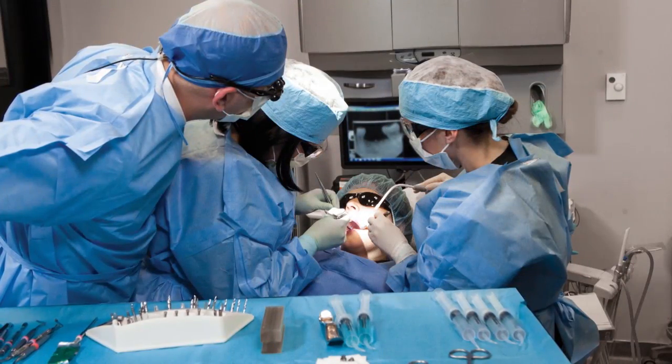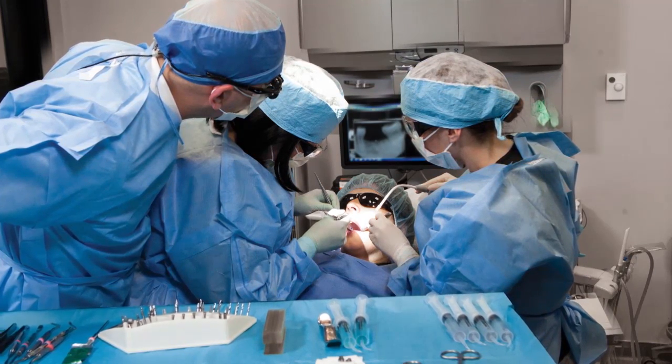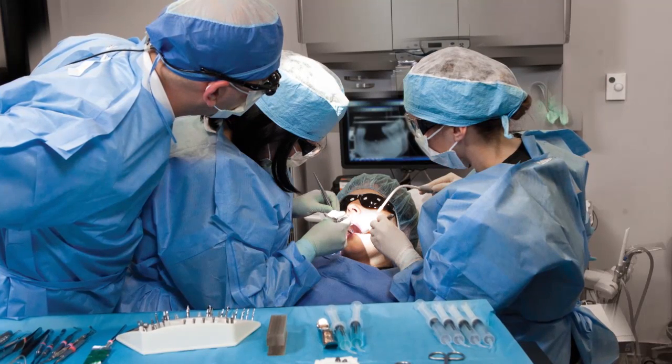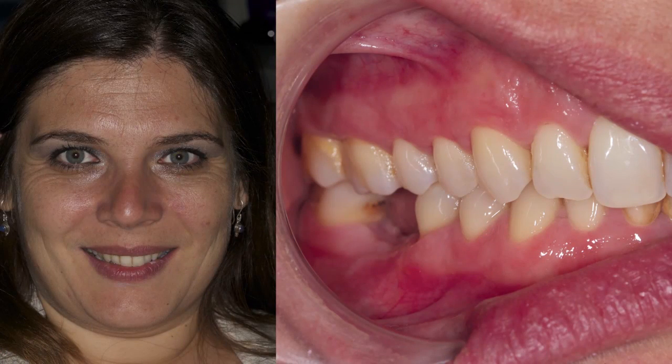For this implant case, I would like to start by saying that it was an implant I placed soon after I graduated dental school. Because of that, I had to rely on a relative or my best friend for that kind of trust from my patient. I was very lucky to have Dr. Abai as an innocent bystander to watch over the procedure. Here is my patient, Nora, a young woman who had an edentulous space associated with the area of tooth number 30. A removable partial denture restored function and maintained interproximal and interocclusal space for a while, until she decided she was ready — or she trusted me enough — to replace her partial with a fixed implant restoration.